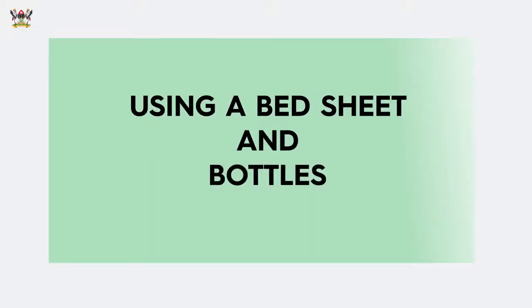Another material we can use to improvise for a rigid cervical collar is a bed sheet. We are going to demonstrate how to use a bed sheet and two mineral water bottles to create rigidity — an improvised cervical stabilization material.